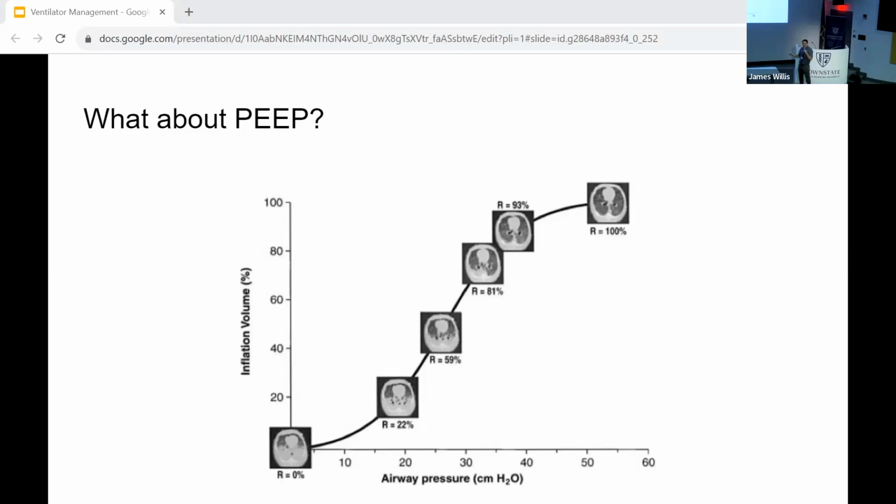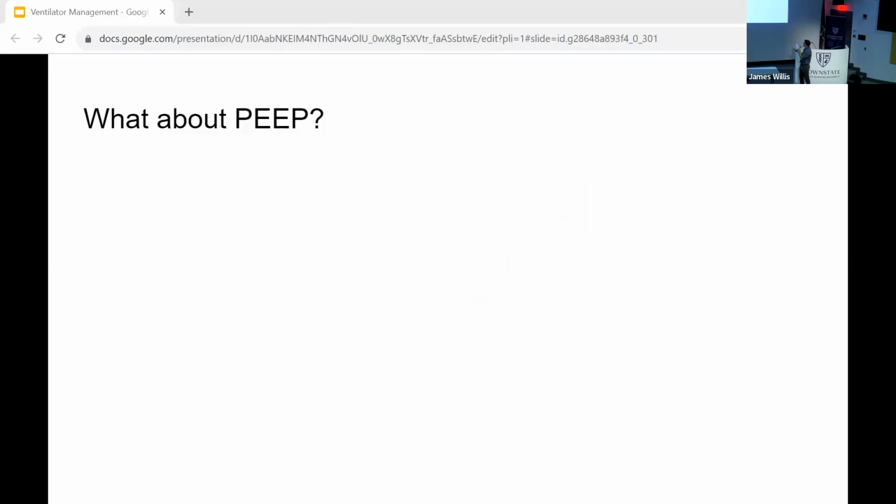And not every patient has the same reserve. So the disease is going to affect a patient differently. And so how you adjust the ventilator will be on a case-by-case basis, and you have to try to troubleshoot through trial and error what is the optimal PEEP. So below, there's a recruitable lung where you could recruit by going up on the PEEP, but if you go too high, you run the risk of overdistending and causing barotrauma and overdistension and ventilator-induced lung injury.